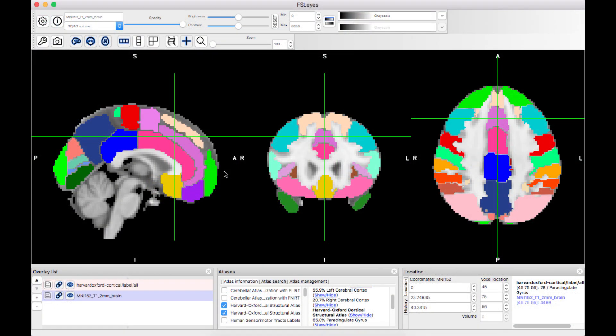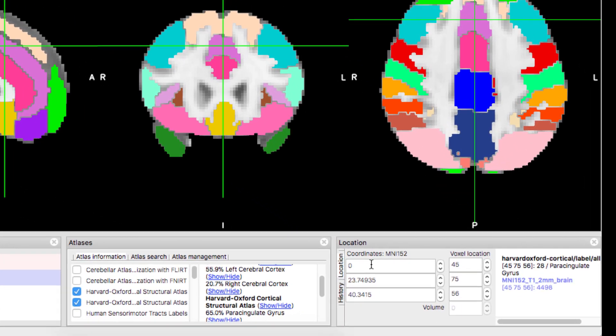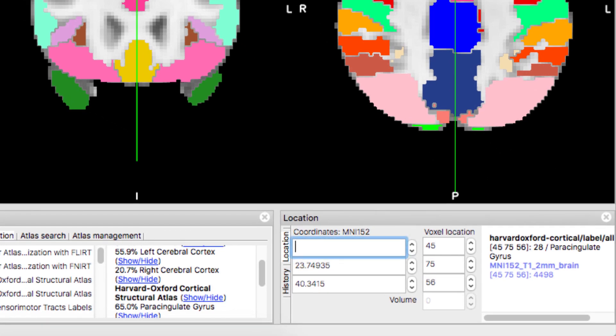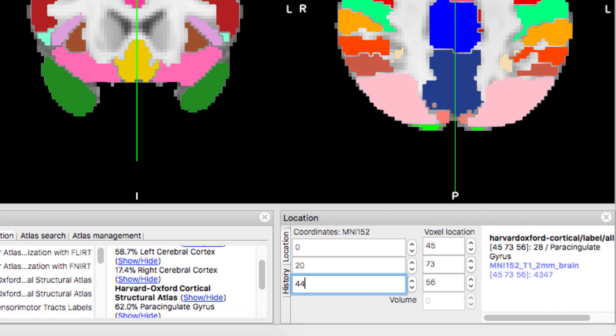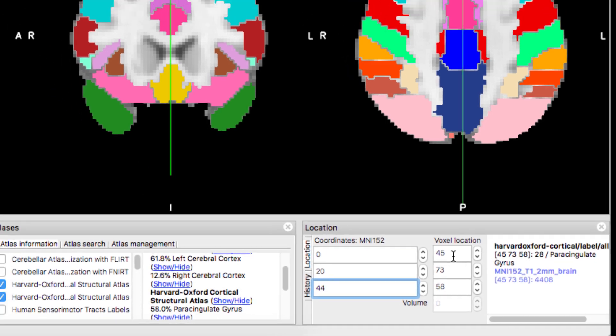We first need to convert these MNI coordinates to voxel space, which can be found in FSLView. Enter the MNI coordinates in these fields down in this window here. And notice how the numbers change over here. And then write down the numbers in the voxel location fields.